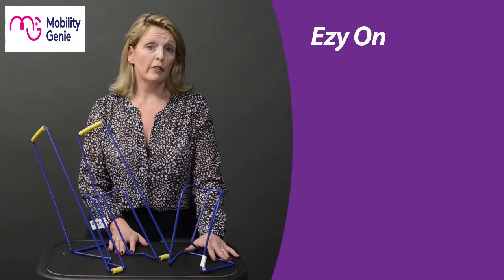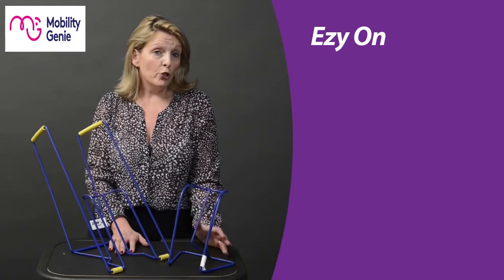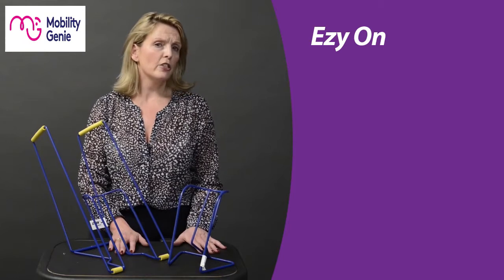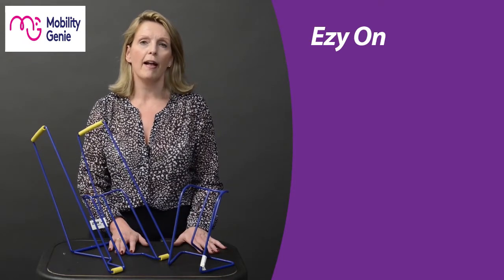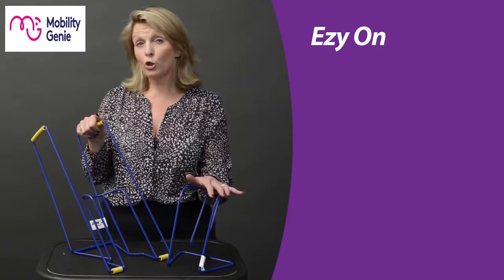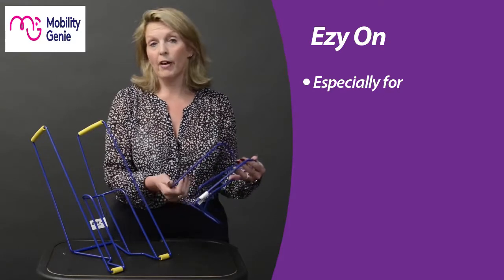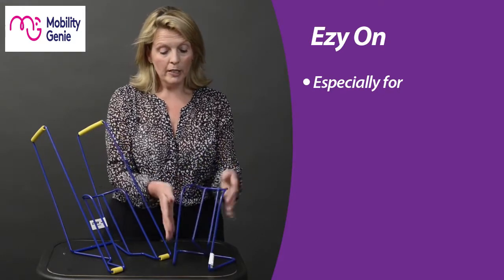Putting on compression hose can be a real challenge for both the person who should be wearing them and also for their carers. Compression compliance is really important to help maintain our health. Here we've got the Easy On range — there are actually two versions: the small and the tall.